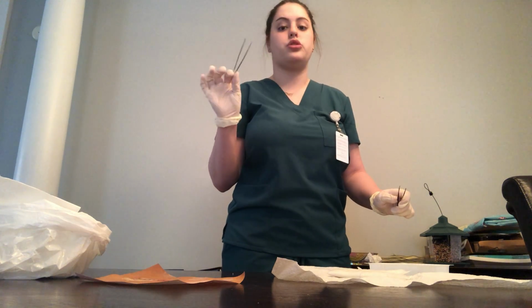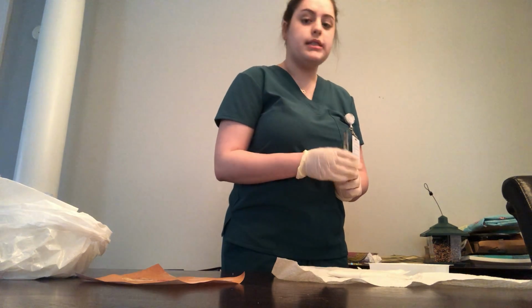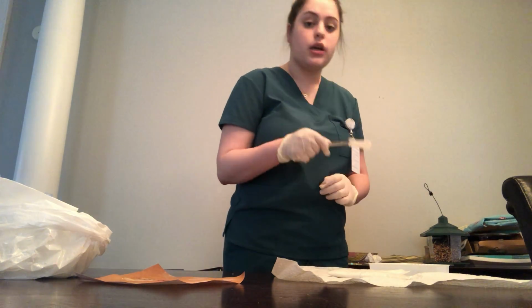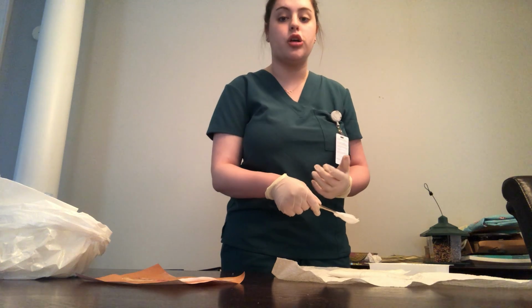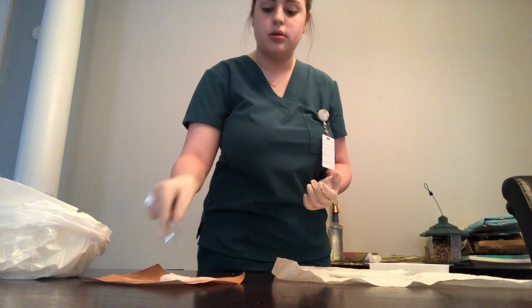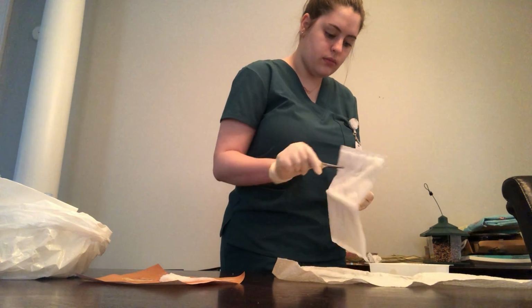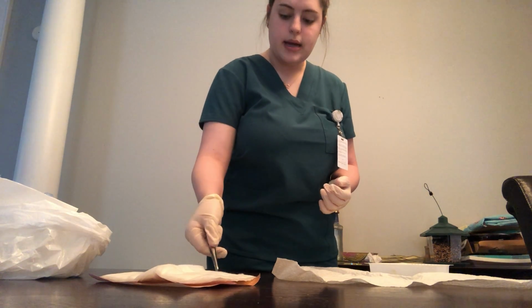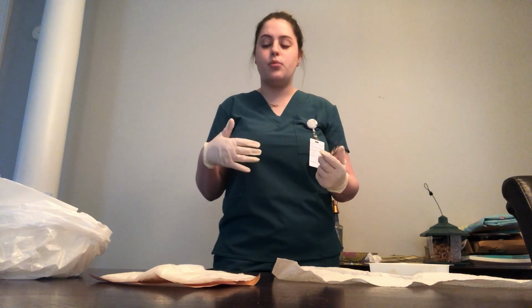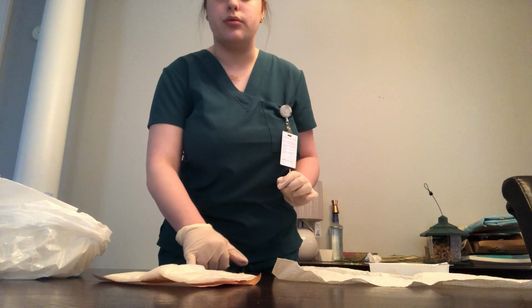These have been in the wound, so they are considered contaminated. You're not going to need them again. They're going to go in the garbage. Taking these forceps, you're then going to place your gauze. So again, like I said, I would have liked to use the 4x4 because they are larger, but I only have 2x2, so that's what we're using. Now I'm going to place the abdominal pad. And the abdominal pad is on. Once the abdominal pad is on, you don't really have to worry about sterility anymore because everything underneath that is covered. So I will be covering the wound with tape now.